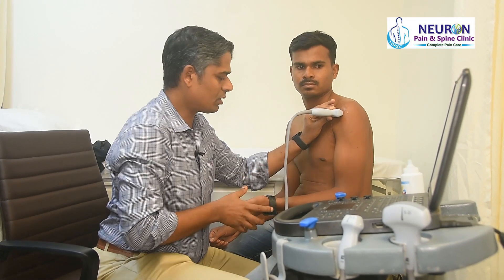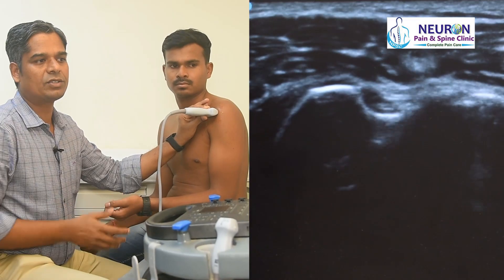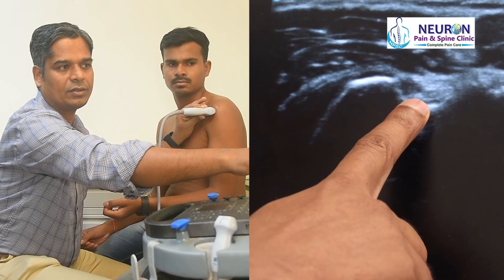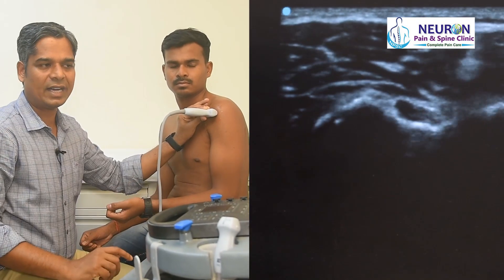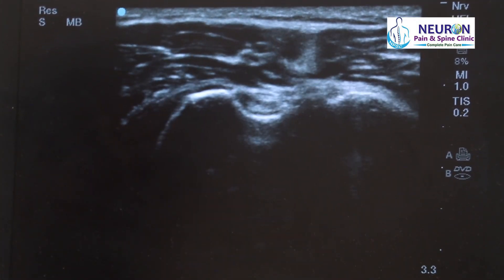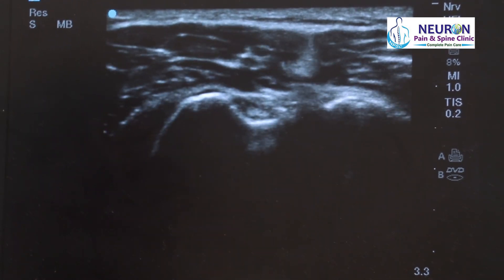In the intertubercular groove, I look for the presence or absence of the biceps tendon. I can see the biceps tendon there. If I toggle the probe a little bit, there is nothing — it looks hypoechoic as if the tendon is absent. If I tilt the probe a little, I can see the tendon very well. This is called anisotropy, a property displayed by tendons and ligaments.